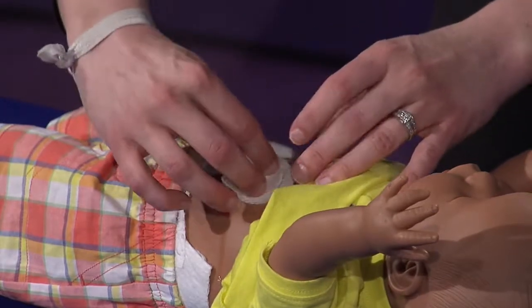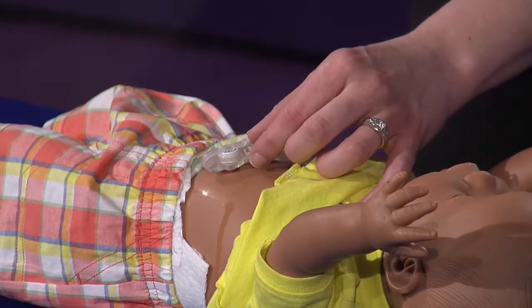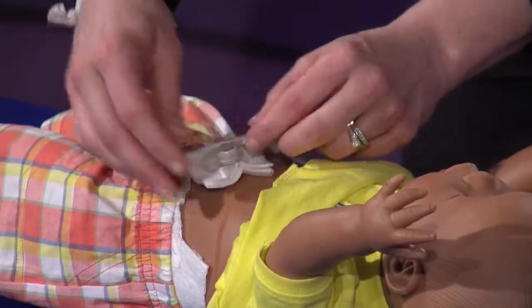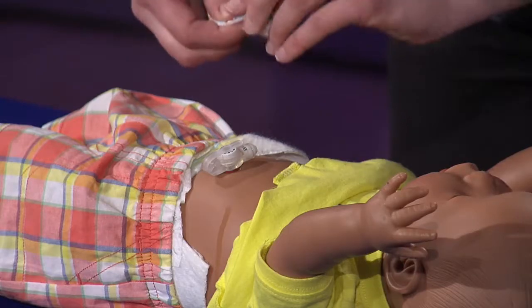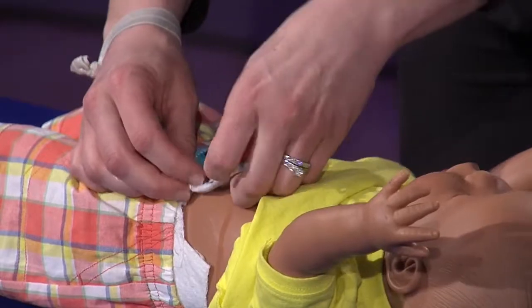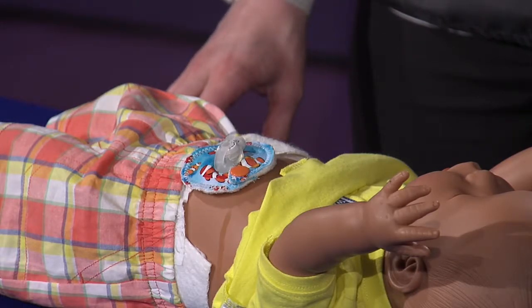Be sure to dry the area well after cleaning with a new gauze. You should then place a dry split gauze under the tube. A button buddy can be used instead 1 week after your child's G-tube surgery if you prefer. Your child may not soak in the bathtub or go swimming for 2 weeks after your child's G-tube surgery. Do not apply ointments or medications to the area unless instructed by your healthcare provider.